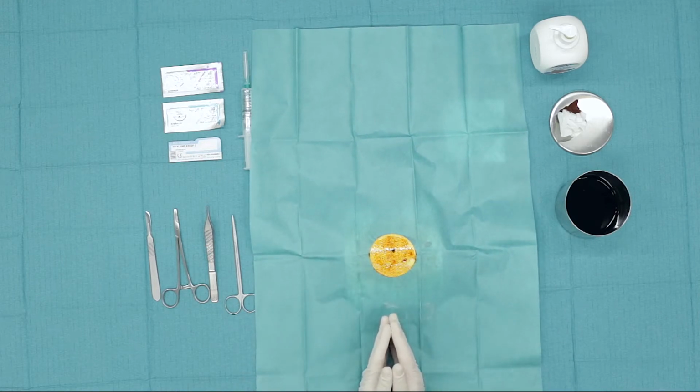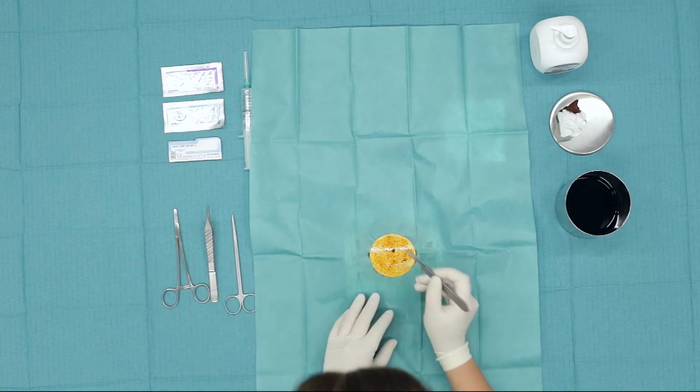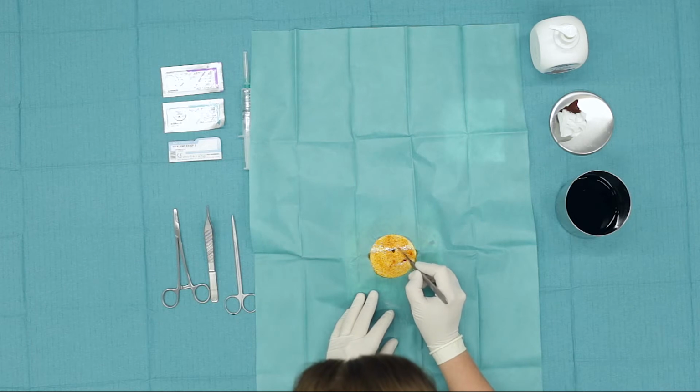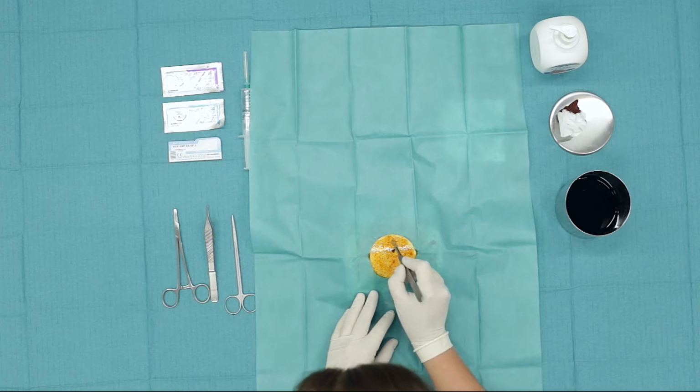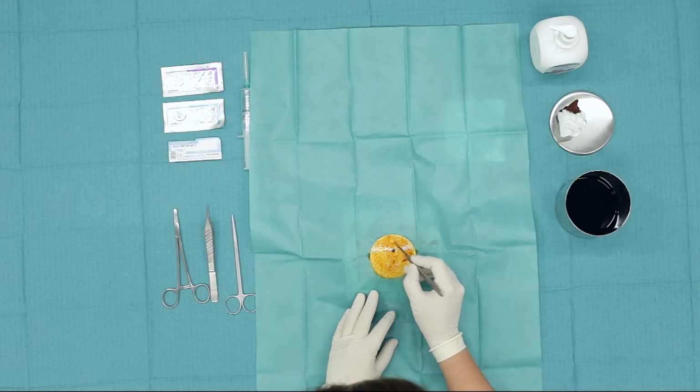The incision that will be made in the skin is spindle-shaped. It follows the direction of the skin folds, and the ratio of the incision is 3:1 in length to width. The ratio is important, for the surgical wound to contract later.